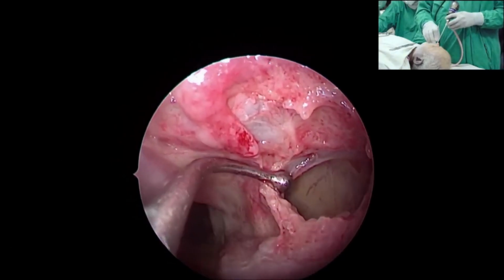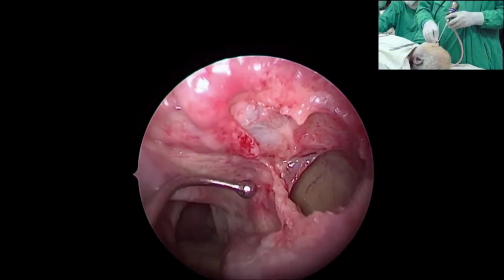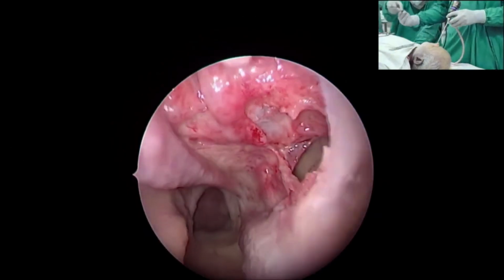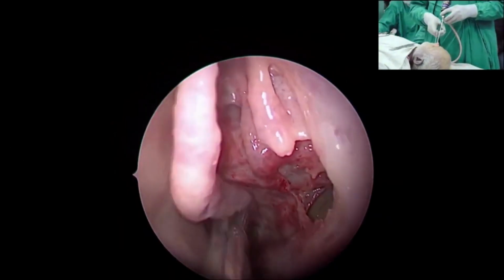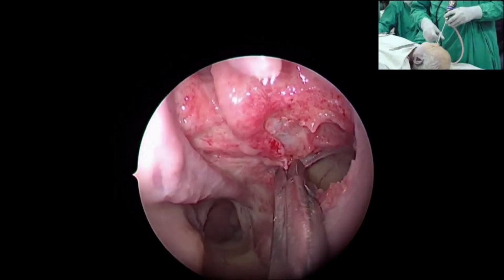How can you enlarge this? See what is there in the posterior wall, medially here. This is the perpendicular plate of the palatine bone. So I can enlarge it at the expense of the perpendicular plate of the palatine bone, posteriorly till the posterior wall. See this?